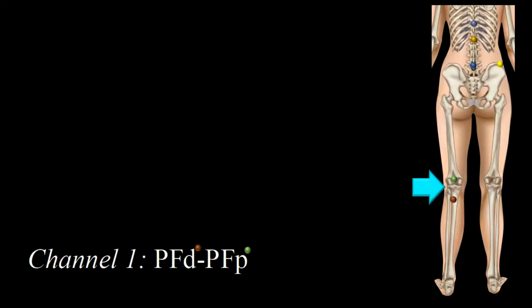The extended montage recommended by the American Academy of Clinical Neurophysiology includes 8 channels. The first channel surveys the peripheral nervous system by capturing the traveling electrical activity as it ascends in the tibial nerve at the level of the popliteal fossa. The D stands for distal and the P for proximal.